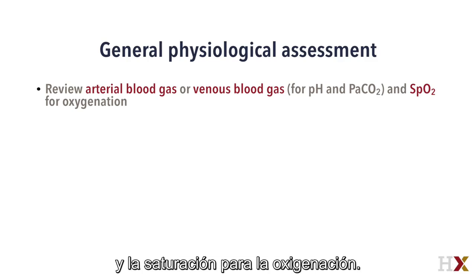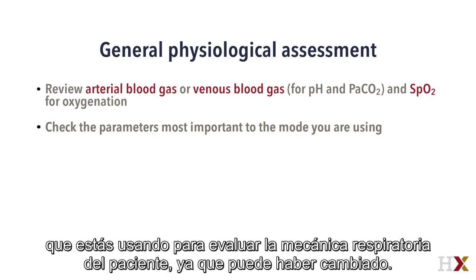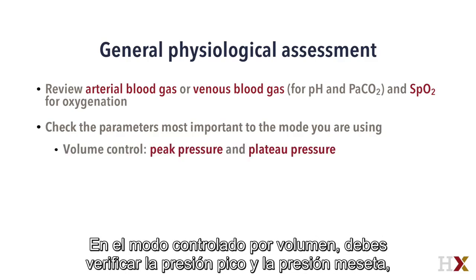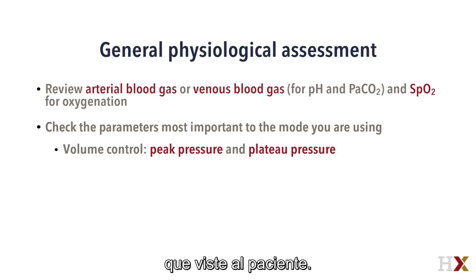and saturation for oxygenation. Check the parameters that are most important to the mode you are using to assess respiratory mechanics that may have changed. In volume control, you need to check your peak pressure and plateau pressure, since minute ventilation would not have changed since the last time you saw the patient.